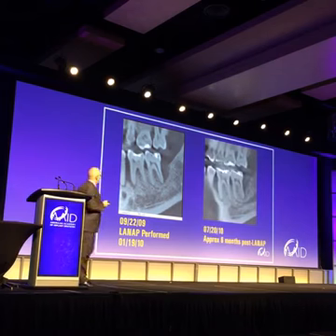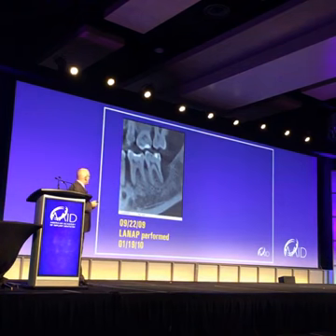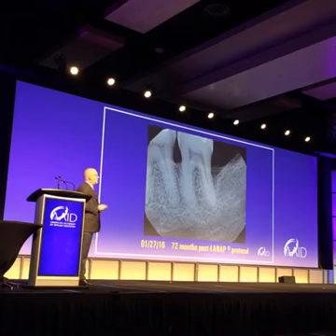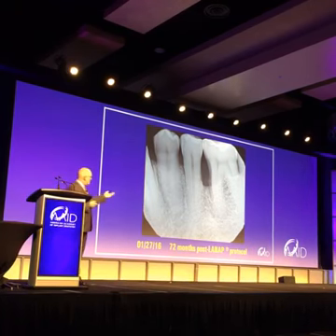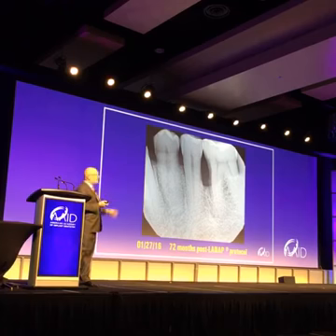Here's what it looked like 6 months later. You know, tissue looked good, all right, fine. If it's looking good, leave it in. Bone was coming back. Here it is 30 months later. 1 treatment, mind you. Here's 6 years later. Here's tooth number 19 that most people would say needed a root canal. Am I going to get bone all the way to the top of the CEJ? That's not going to happen. But I've got bone, and the rest is just, he comes in for regular maintenance every 3 months. The guy's amazing. Implant or something else.